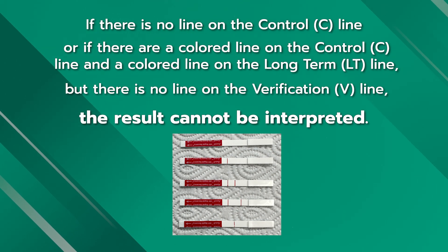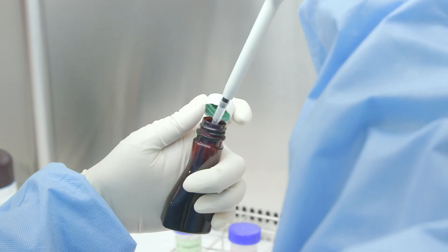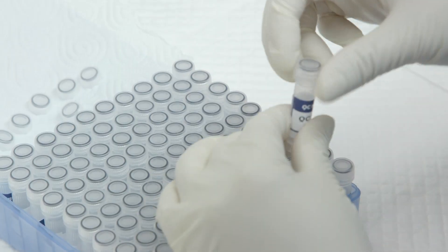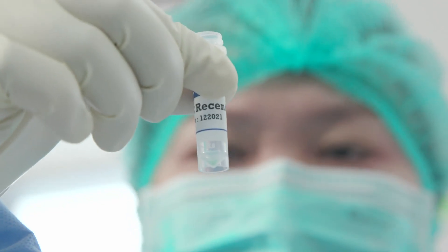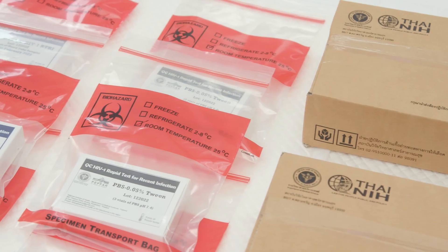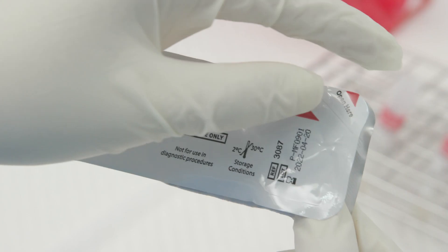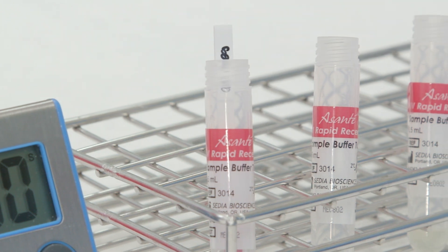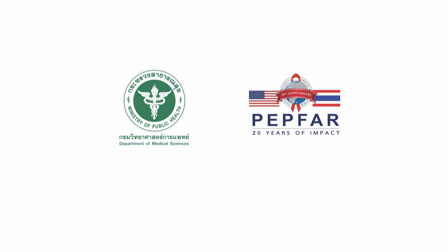Quality control sample testing should be done each time a new lot of kits is used to verify the reliability of a new HIV testing system, or when the test kit has not been stored in the temperature range specified by the manufacturer of 2–30 degrees Celsius. These are all the steps in the procedure for testing dry quality control samples to detect recent HIV infection using the HIV-1 rapid test for recent infection. Hopefully this video will help you follow the correct steps.